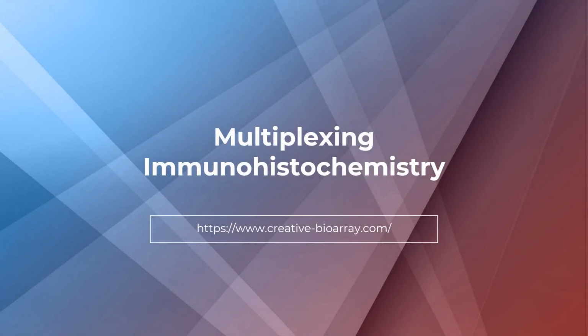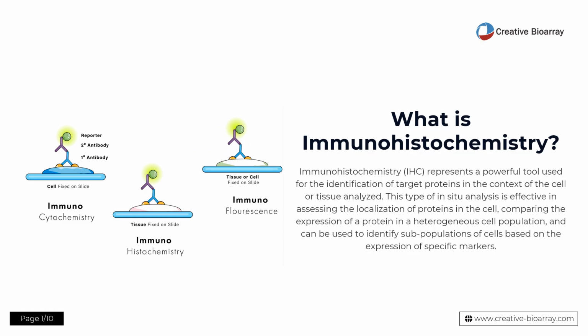Multiplexing immunohistochemistry offers an unmatched insight into spatial proteomics in a variety of cell populations and bridges the gap between high-throughput and single-cell technologies. Immunohistochemistry, IHC, represents a powerful tool used for the identification of target proteins in the context of the cell or tissue analyzed. This type of in situ analysis is effective in assessing the localization of proteins in the cell, comparing the expression of a protein in a heterogeneous cell population, and can be used to identify subpopulations of cells based on the expression of specific markers.